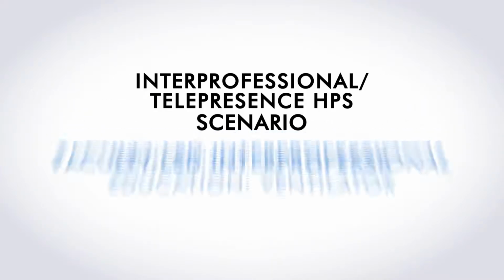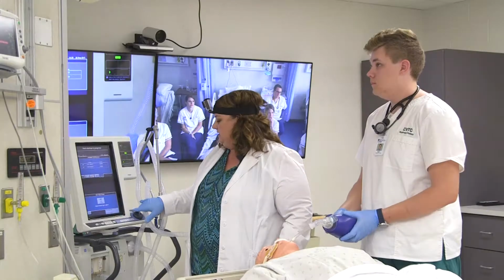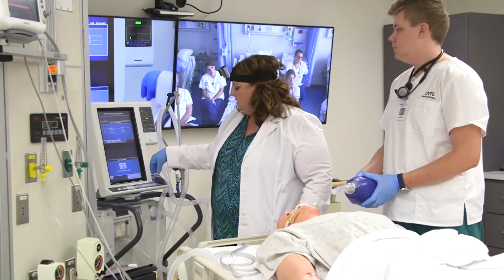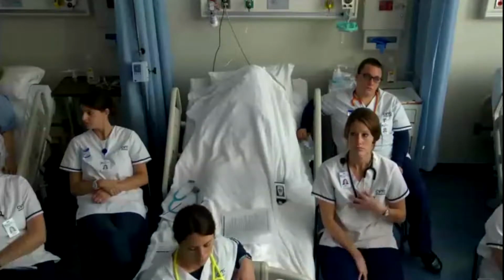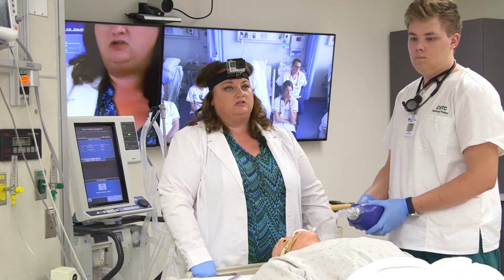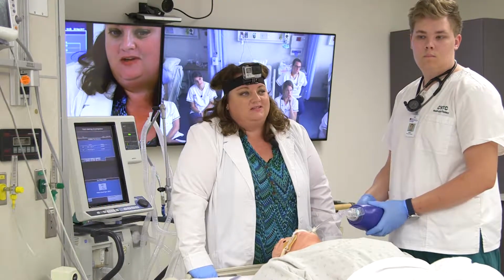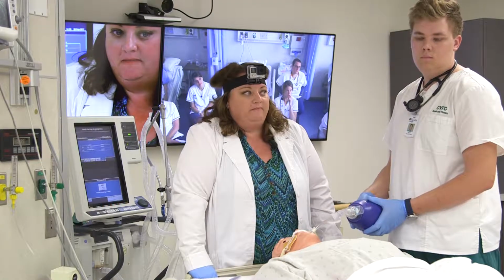We're going to set up the patient on the ventilator. So first couple things we got to do is we need to decide how big he is. So can somebody tell me how tall Patrick is? 5'11". So what does that mean? We set patients up using ideal body weight in kilograms. So can one of my students tell me what his ideal body weight is in kilograms?